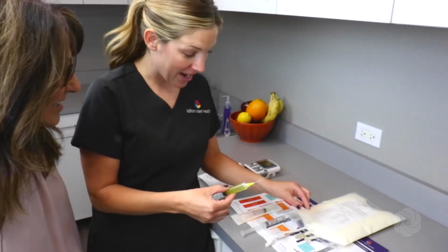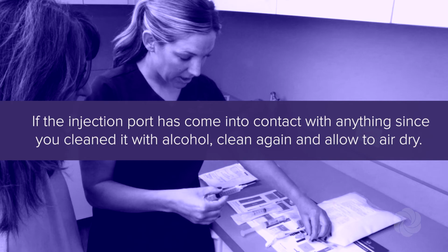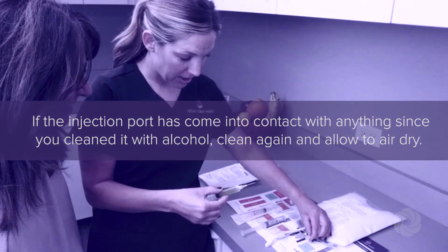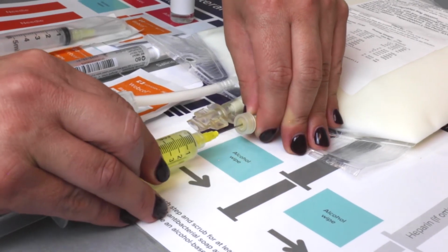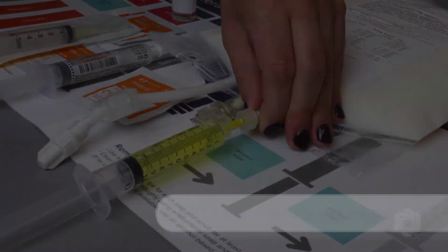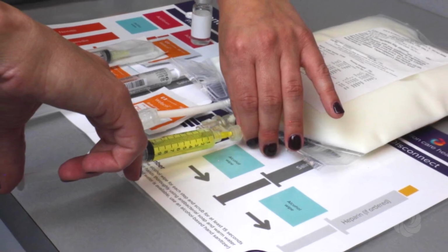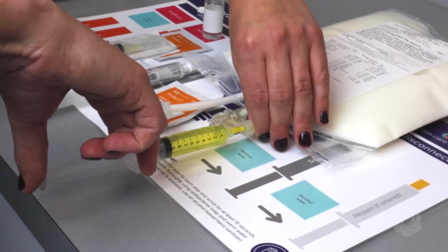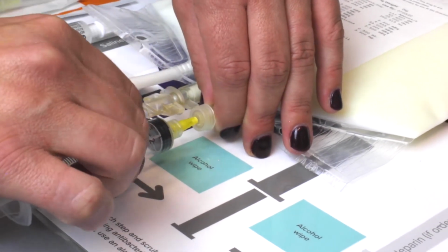Locate the injection port on the PN bag. If the injection port has come into contact with anything since you cleaned it with alcohol, clean it again and allow to air dry. Insert the needle straight into the PN bag's injection port. Be careful not to puncture the bag. Once the needle has been inserted into the injection port, place your thumb on the plunger and slowly inject the vitamins into the PN bag.